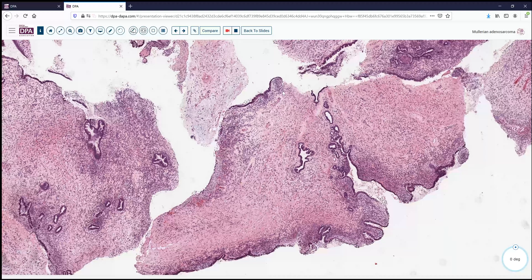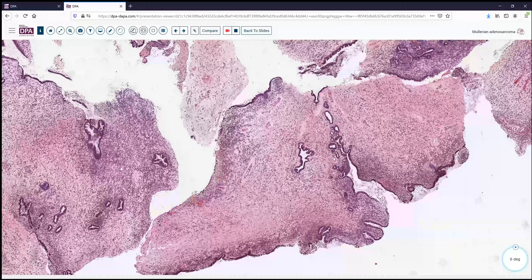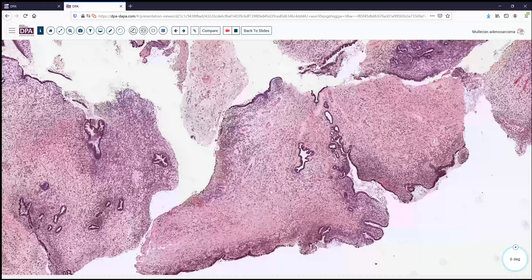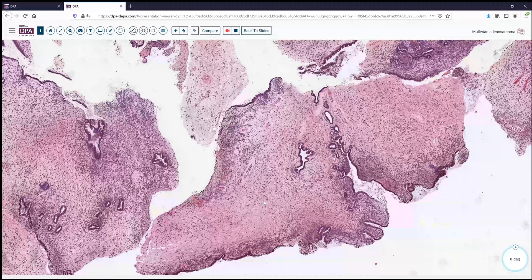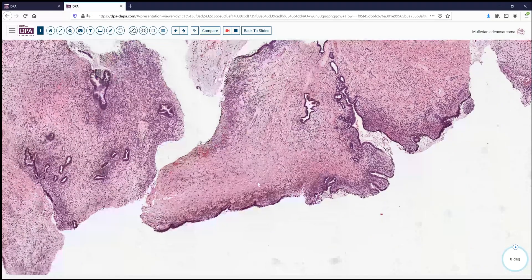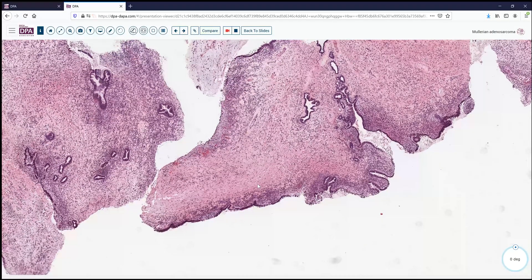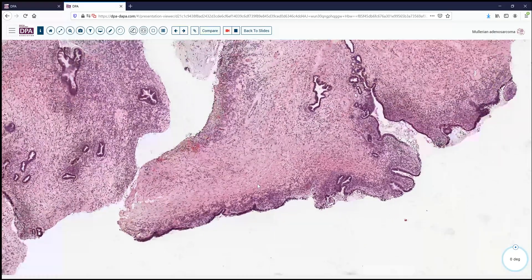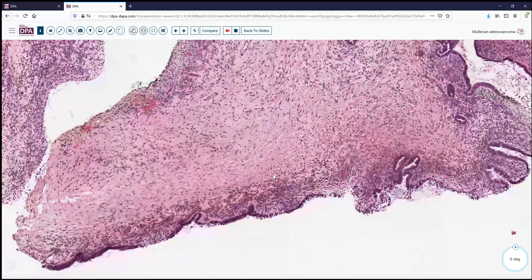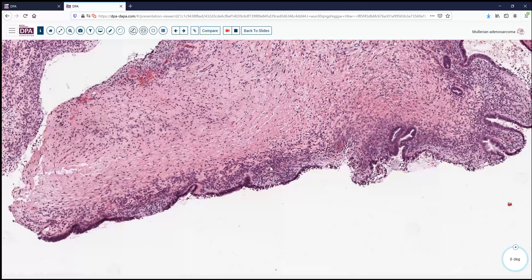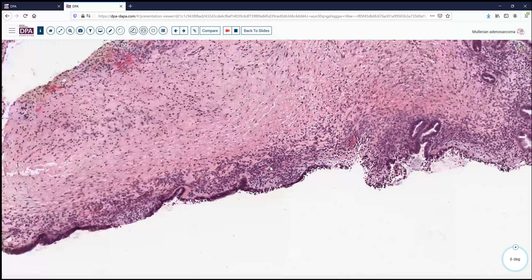There is a somewhat more cellular zone immediately beneath the epithelium, then trailing off into a more pink, hyalinized stroma centrally — a pattern that is fairly characteristic for this lesion.